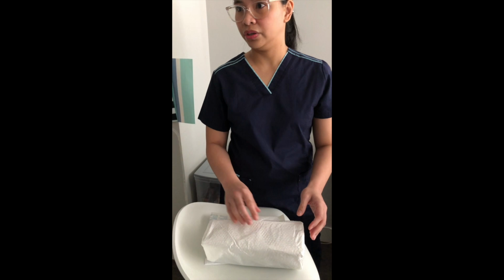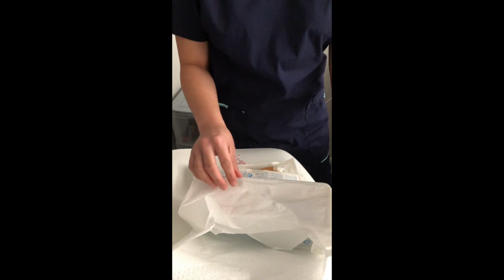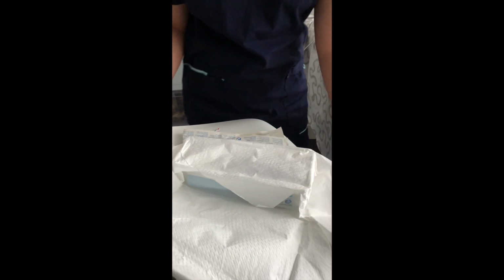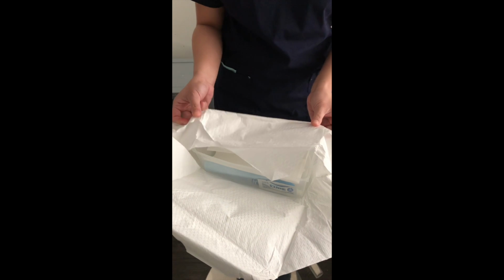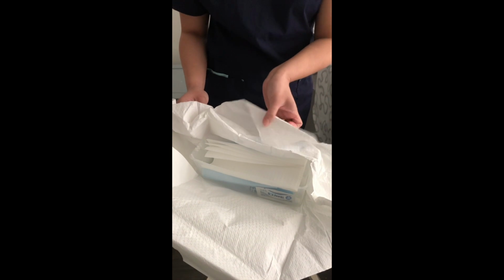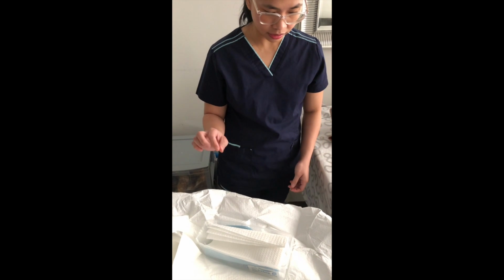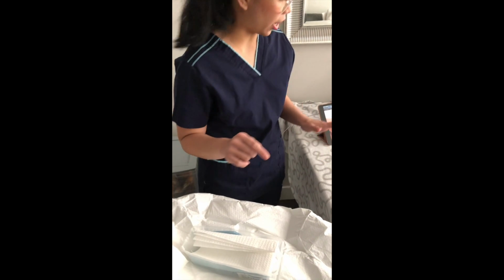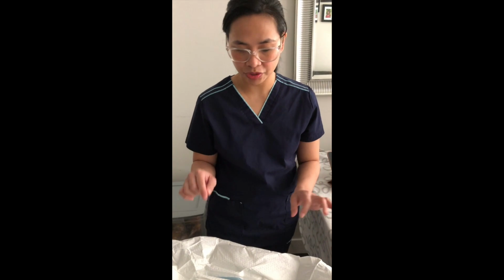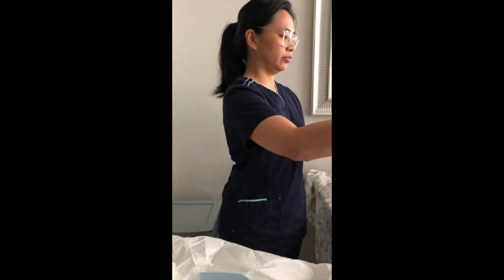Make sure you have the appropriate size for the Foley catheter, your sterile gloves, and your urine bag. Okay, so you can open your Foley catheter kit. You have to put an underpad on the patient, so I'm sure there's one here, so you can just get it. Make sure you haven't contaminated the rest of the inside of the kit.